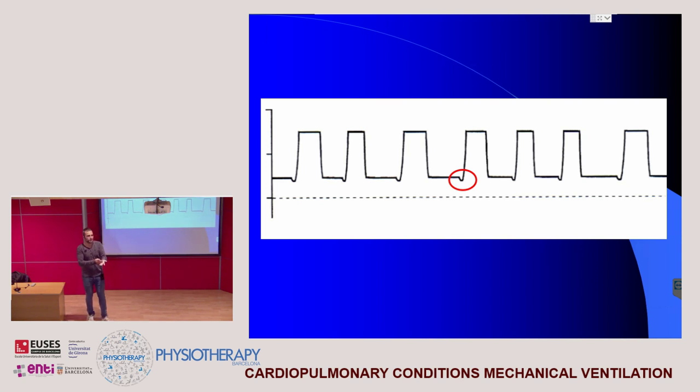The ventilation unit is very clear, very specific: 1.3 seconds inspiration, 1.8 seconds expiration. But in spontaneous breathing, we do not decide how many seconds we want to inspire and expire. We breathe and that's it. So here we can see the difference in the length of respiration. It's the patient who is breathing, and the only thing the machine does is help.